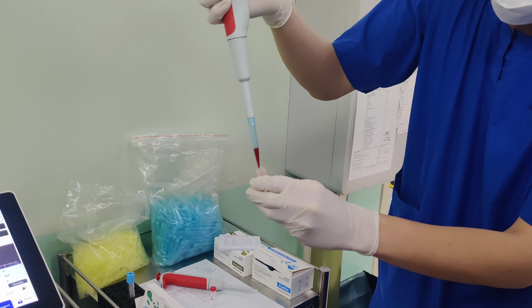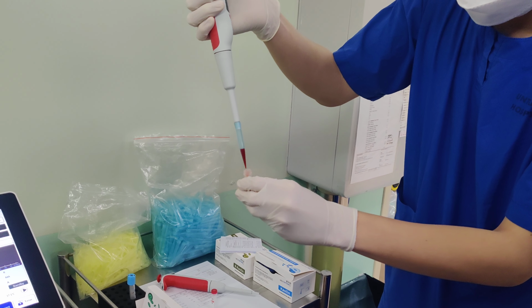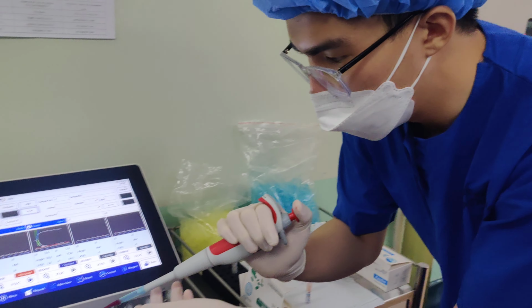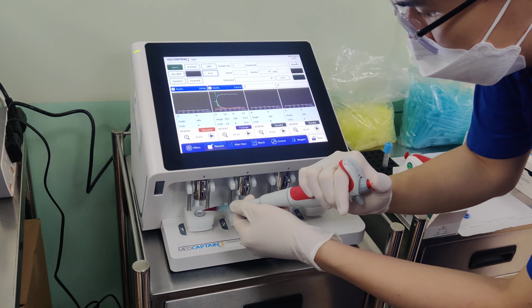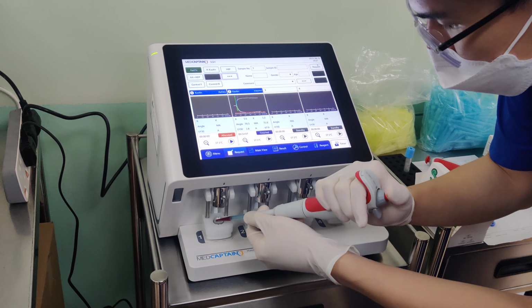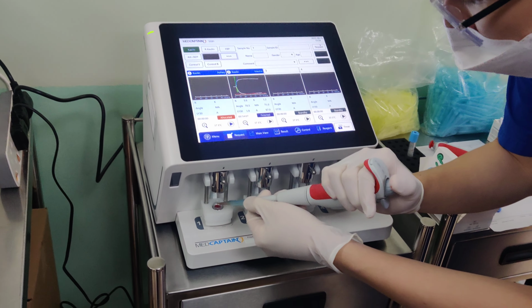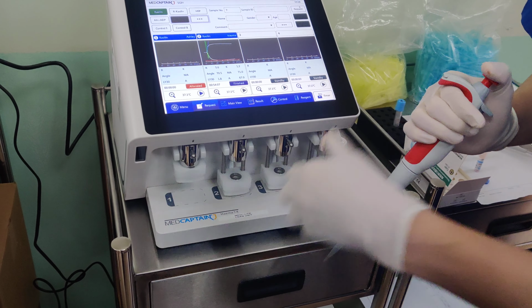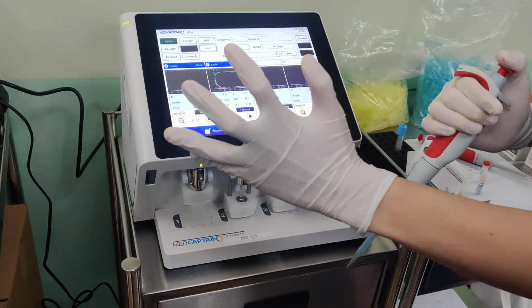This will be 340. So when we add it, the tip has to be touching the wall, and then we release it in one smooth motion. Just press it. Once trigger and blood come into contact, the process already starts, so we have to start immediately.